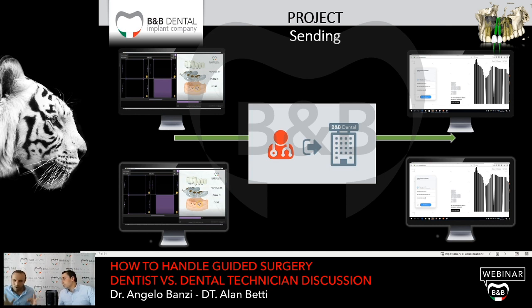The parallelism is absolutely required when you use a normal, standard abutment. So you have to parallelize all the implants perfectly with the abutment. With an angulated abutment, 15 and 25 degrees, you can use this abutment to parallelize all the implants in a proper way.